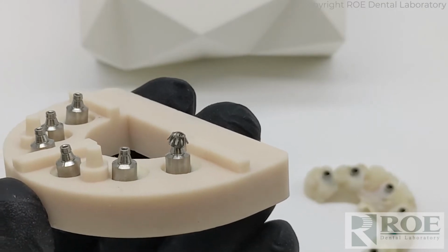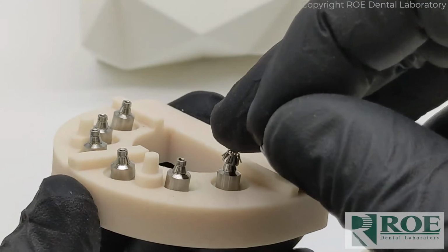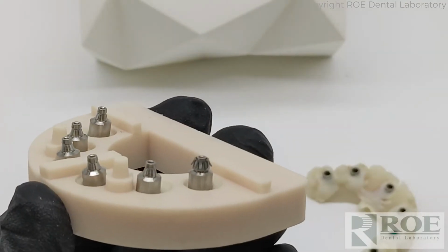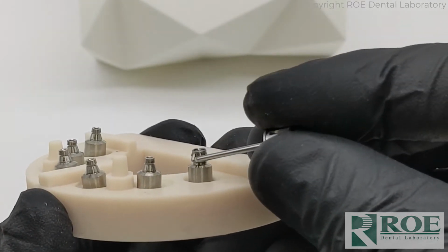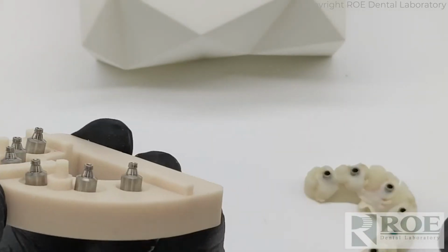Permanently. The patient doesn't take it out. It has to come out with a Smilekey. So let's go through and we'll put these little copings on. There's one. And the trick is that when it's on, you should be able to spin it. If it spins, see how it pops up? We don't want it to pop up.